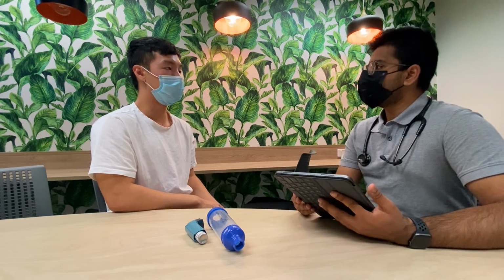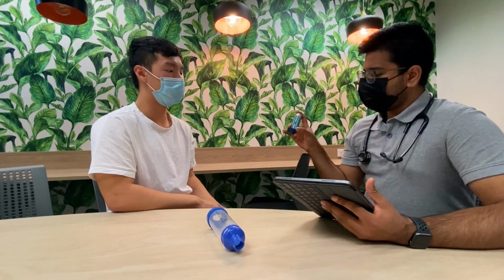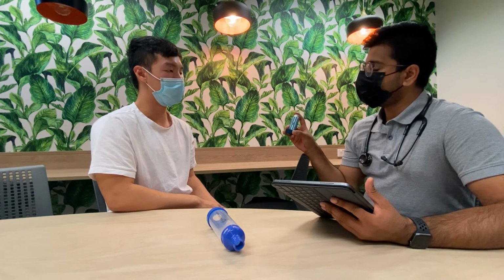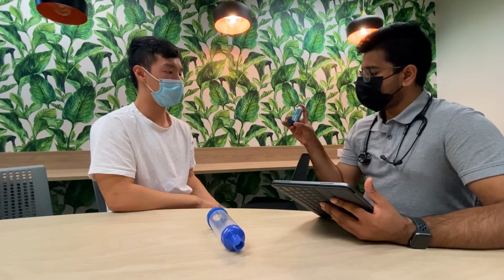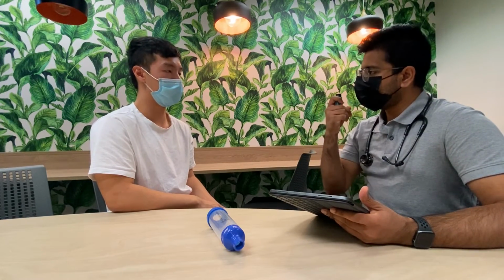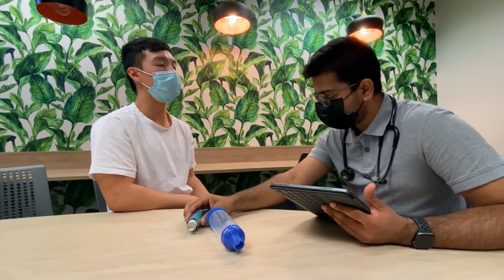When you did mention the using of the Ventolin, it was just a little bit confusing how you mentioned them to wrap their mouth around it. So I would say, take the cap off, put the mouthpiece tightly around your lips, and that just could have been done a little bit better.